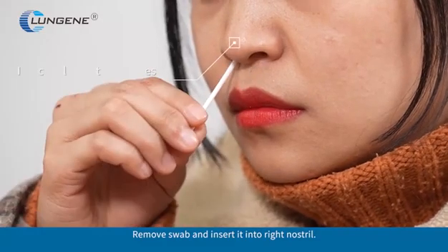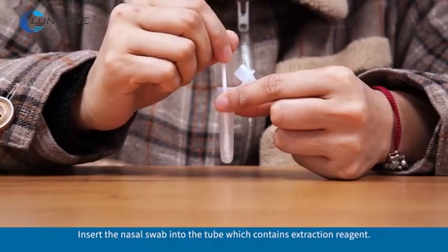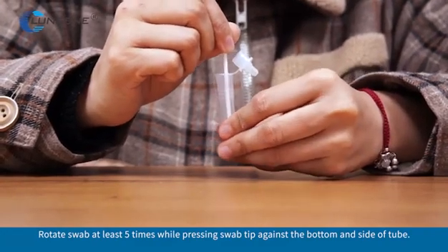Remove the swab and insert it into the right nostril. Then insert the nasal swab into the tube which contains extraction reagent. Rotate the swab at least 5 times while pressing the swab tip against the bottom and side of the tube.